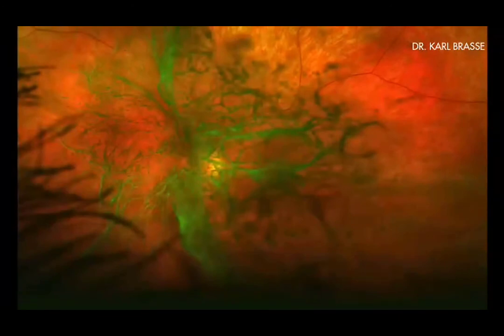The central retina in the Optos scan is hidden behind a curtain of amyloid. As said earlier, vitrectomy was already scheduled. The girl is just 22 years old. Aren't there alternatives, she asked me.